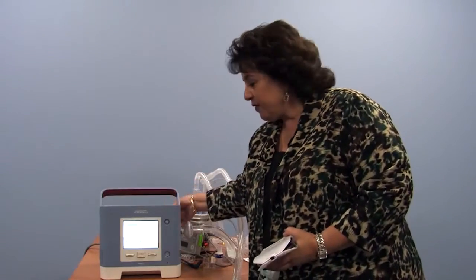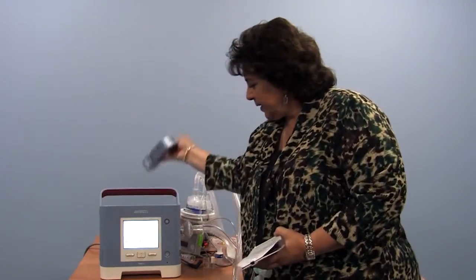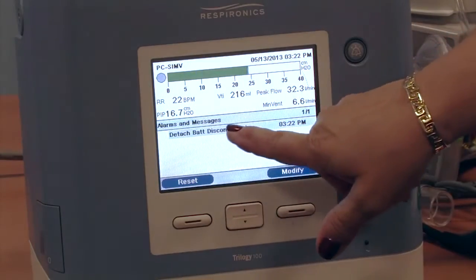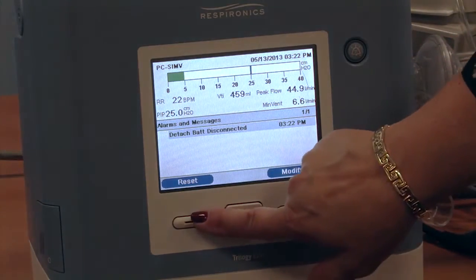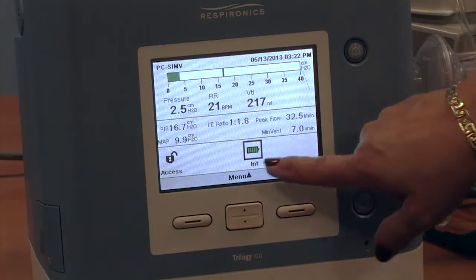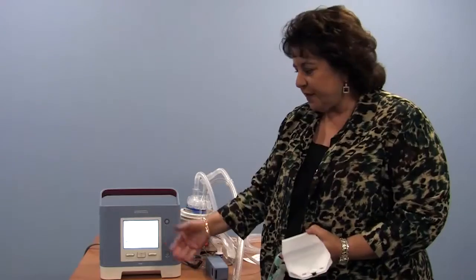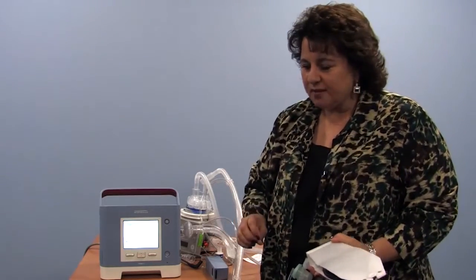So what if I remove that? Here's the 3-hour battery. I've taken it out. Detachable battery disconnected. Reset again. Now we're using the internal battery. When this is depleted to a certain percentage, it would certainly notify us. There are about 15 pages in the manual with regard to power, so you're welcome to sit down with a cup of coffee and take a look through all of those.